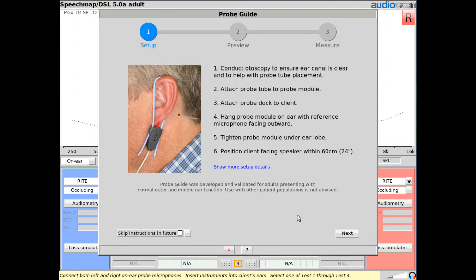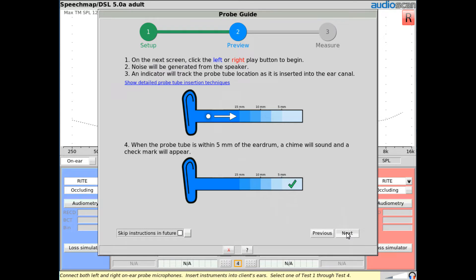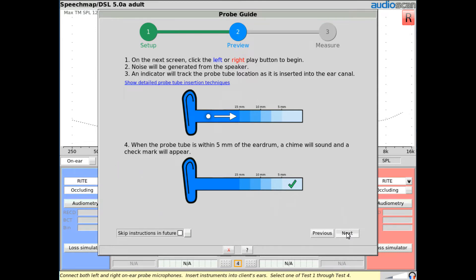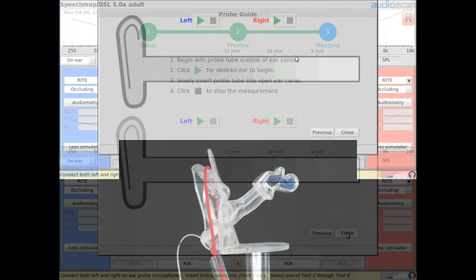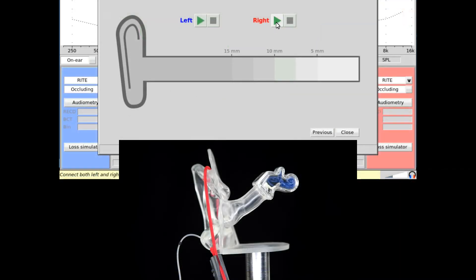Click next to move to the preview screen where the use of ProbeGuide is clearly explained. There's a selection box in the lower left corner which allows the two instruction screens to be skipped in future when ProbeGuide is launched. On the measure screen, simply click the play button to start the placement on the ear of your choice.